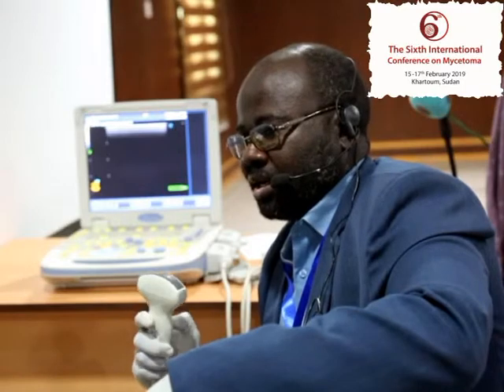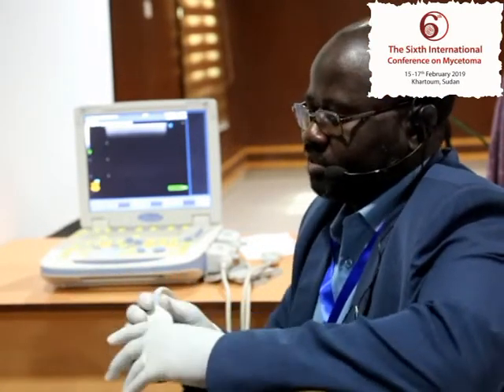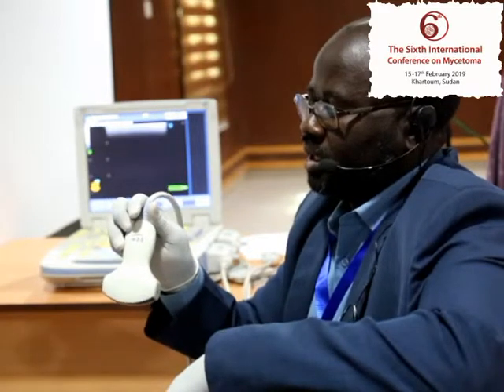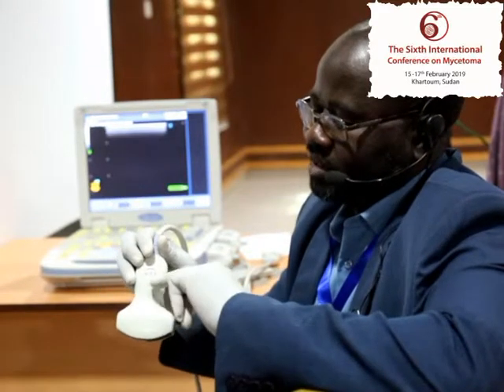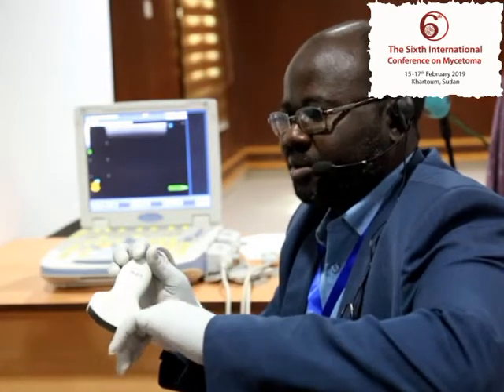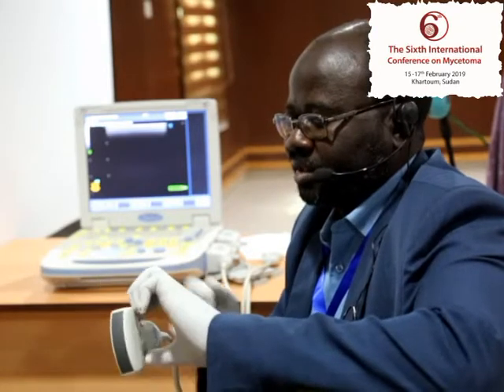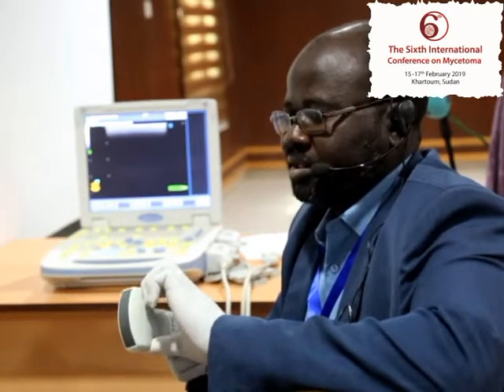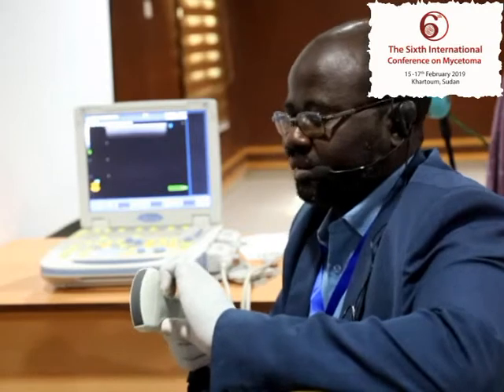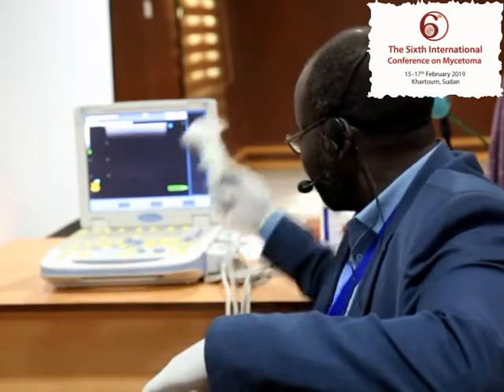The other probe that we use is this one. This is a convex probe. The frequency of the convex probe ranges from 2 to 5 megahertz. This is a low frequency probe. It penetrates deeper. Through this probe we can image the kidneys, the liver, the pelvic structures, the spleen and the rest.